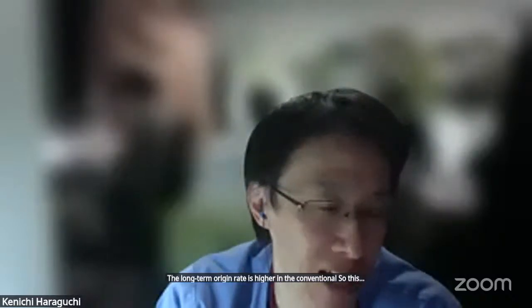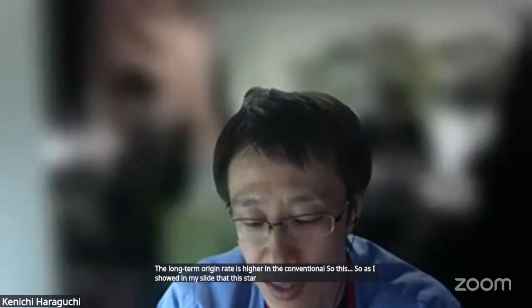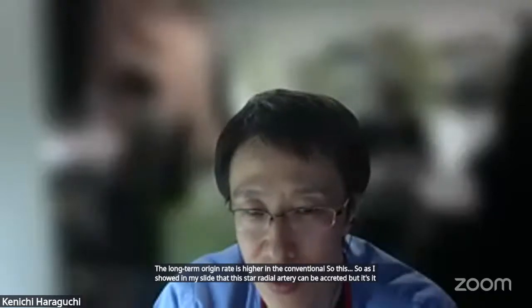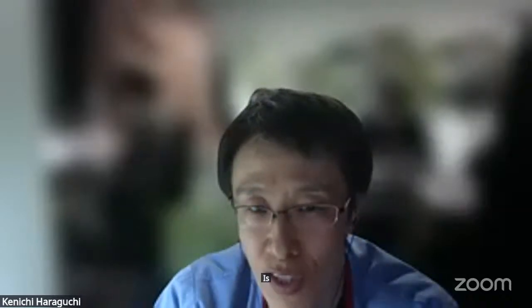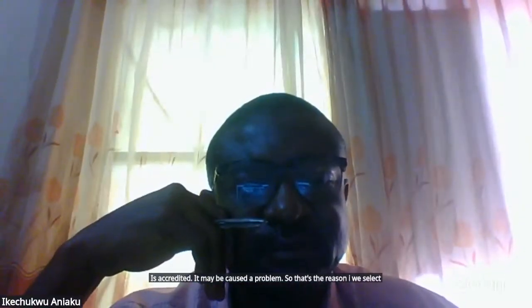As I showed in my slide, the distal radial artery can be occluded, but it has no problem. But if the main trunk of the radial artery is occluded, it may cause a problem. So that's the reason we select the distal radial approach.